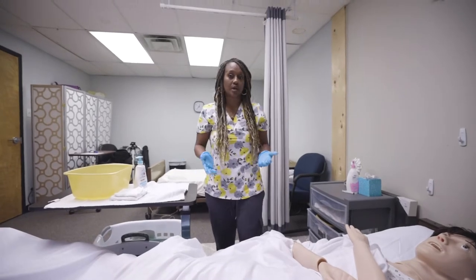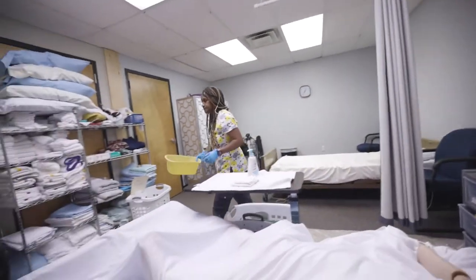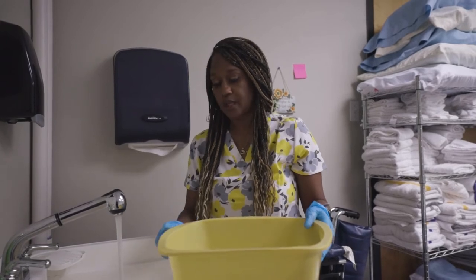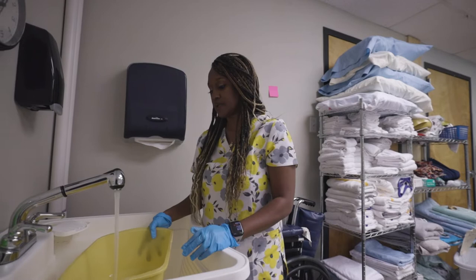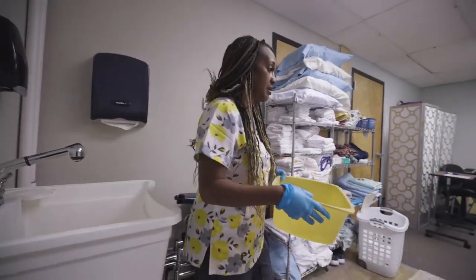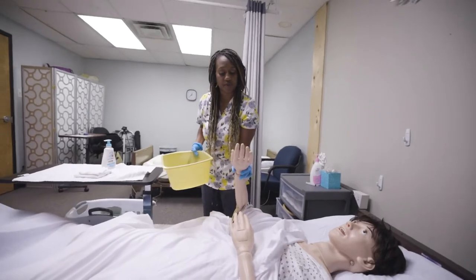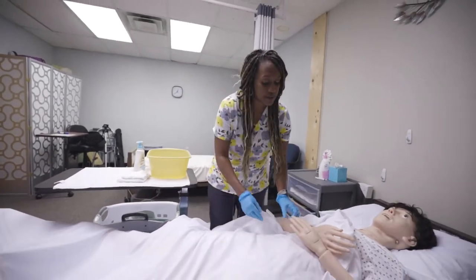See how long that took — if you had gone to get your water first, it would be getting cold. Mrs. Smith, would you like your water on the warmer or cooler side? Warmer — all right. Even though it's a mannequin, this is a skill test and you really need warm water. I test it on my wrist — either here or here — it's more sensitive than my fingertips, which can be compromised by calluses. Mrs. Smith, I've tested the water; it feels good to me — you tell me what you think.